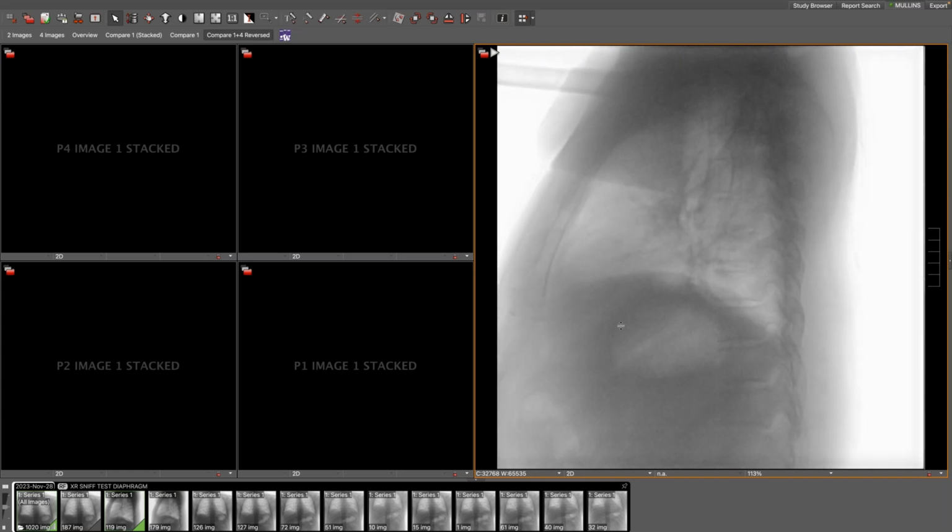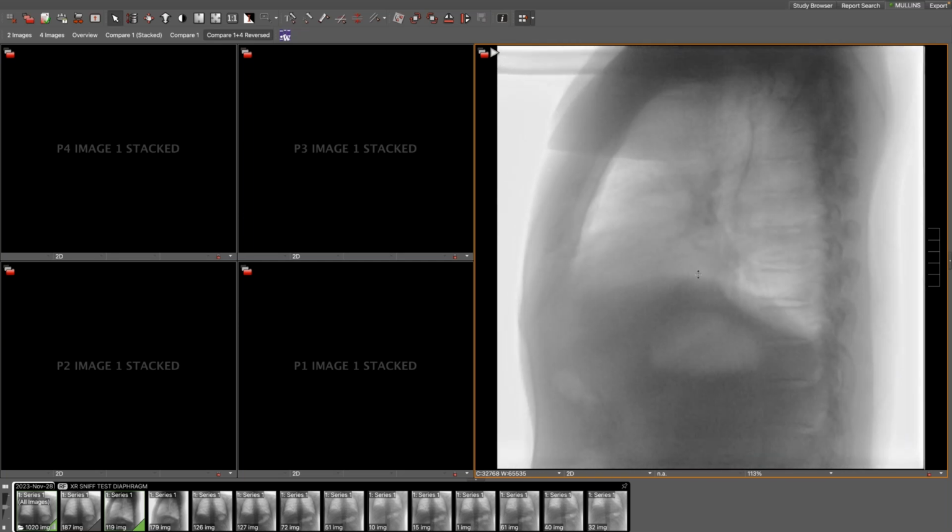So the diaphragm and the chest wall should move away from each other. The chest wall is going to move up and forward, and the diaphragm is going to go down at the same time. But you see when he stresses things by sniffing, his diaphragm actually leaps up, it follows the chest wall passively. So that's bizarre. That should not be happening. It looks so good when he takes a nice deep breath, everything moves normally.